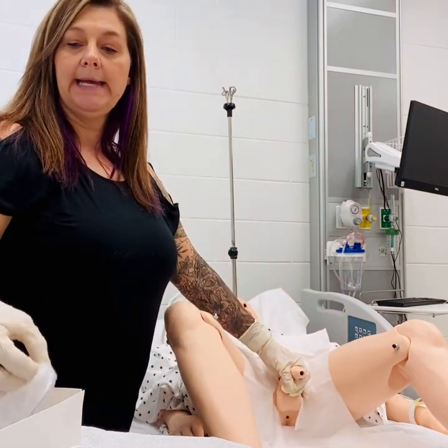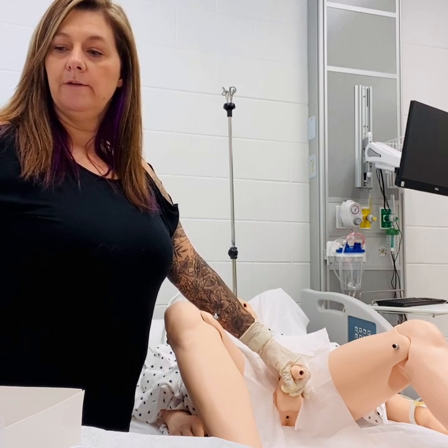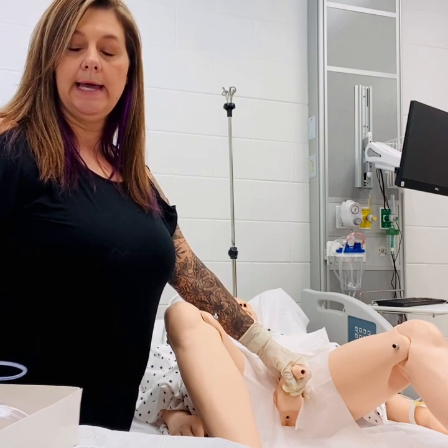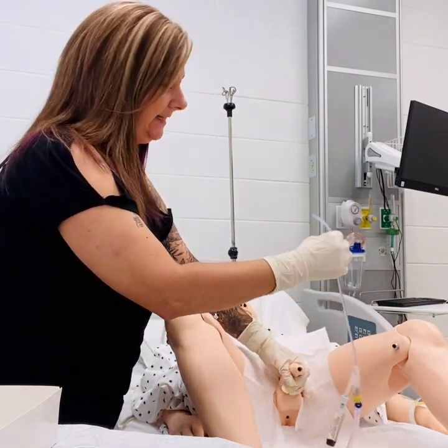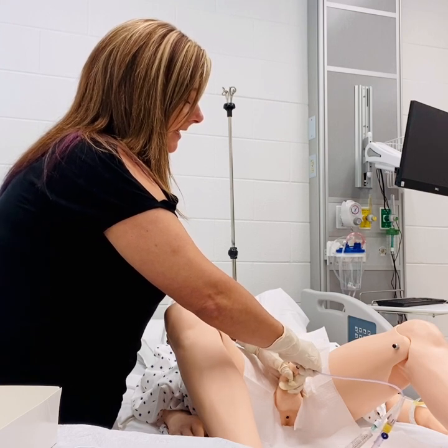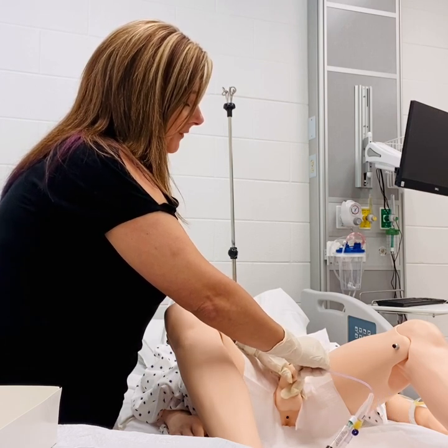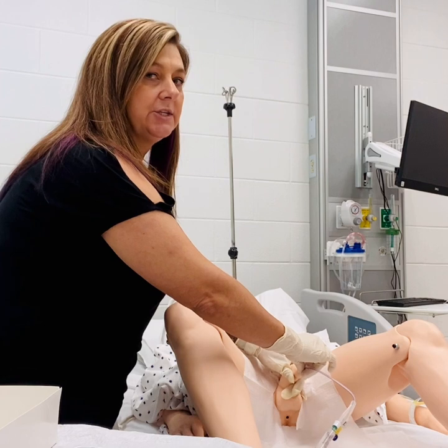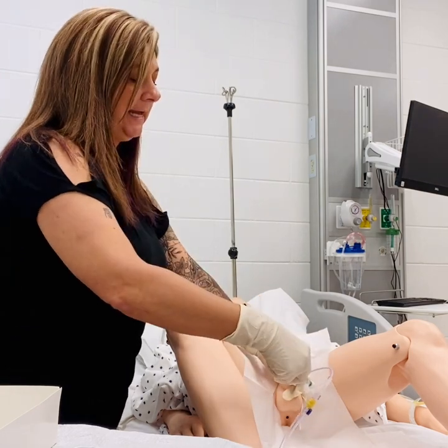Now at Foley catheter insertion for the male, you want to insert this a little further than we did with the female. Again, you need that catheter lubricated just as before. We're going to pick up our catheter and insert it without contaminating the end of the catheter tip. Ensure your patient is prepared, as this will have to go in a little deeper and a little further than with a female. Once again, once you have urine flow, you will stop and then advance just a little further. Ensure that you get past the prostate area on the male patient, and then you can inflate your bulb.